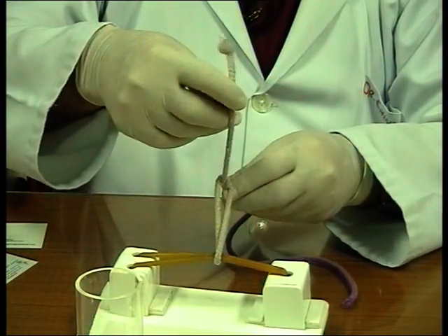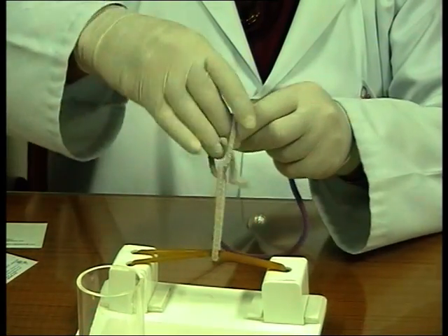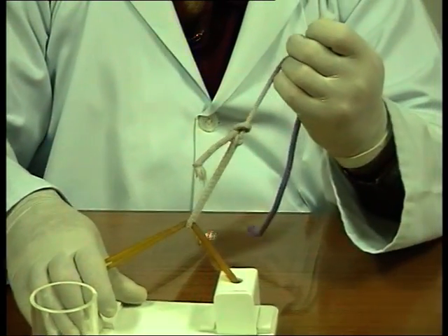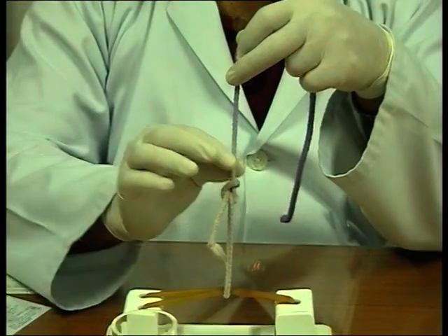Right? Now the short end is away, long end is towards me. I don't care, I still put a middle finger. I have done both the things correctly. I put an index finger throw, I put a middle finger throw. The only thing I didn't do was cross. It becomes a slip knot.